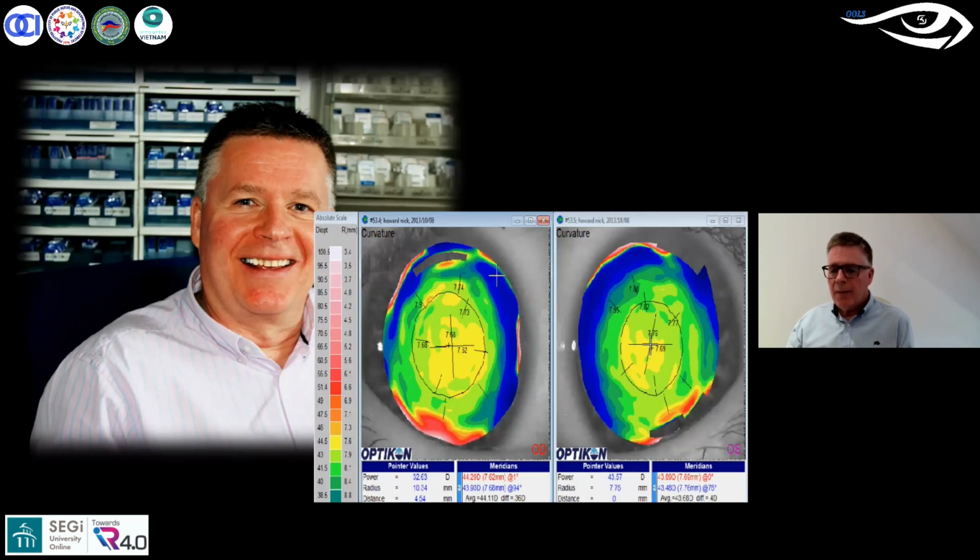That's me. You'll remember my friend Ros from central London. She took these images of me way back in 2013. And these were very deliberate. There was a good reason for taking these images. We were doing an exercise on assessment of contact lenses with a corneal topographer with the pre-lens tear film in mind.